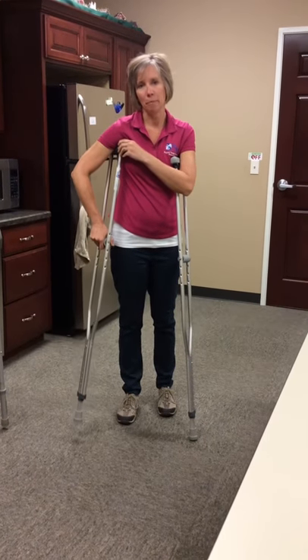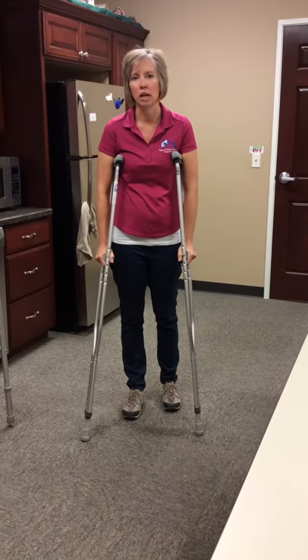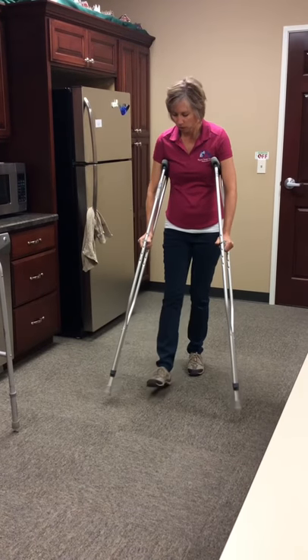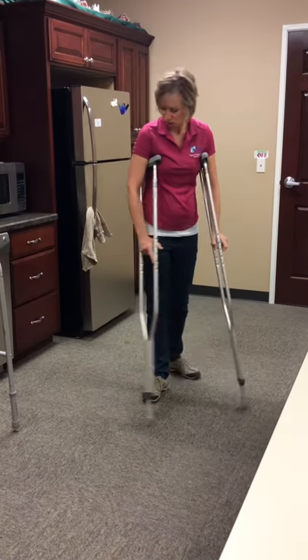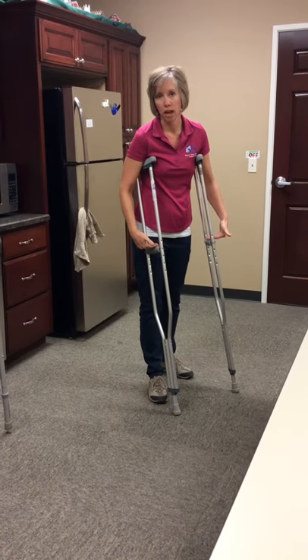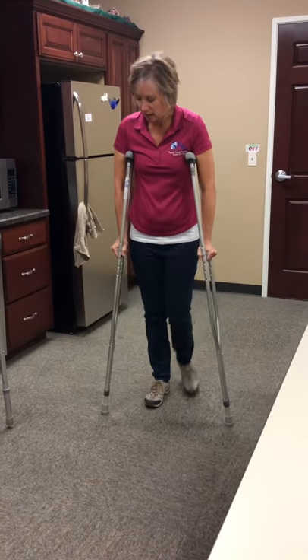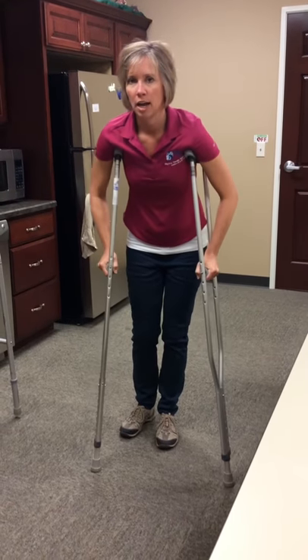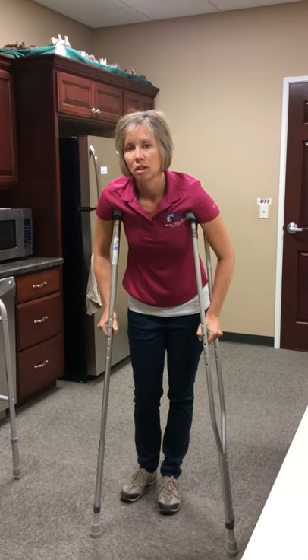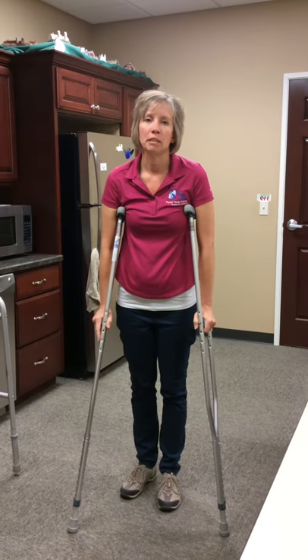You don't want the crutch resting up in the armpit because you could get a lot of compression of some nerves, and we don't want any hands going numb or tingling. You want to be pushing through the hands so there's a little bit of bend in the arms — you don't want the arms too straight. Make adjustments at the hand rest as well. The crutches stay out ahead and you push through the hand rest, not the armpits, as too much pressure there can lead to nerve damage and numbness and tingling in the hands.